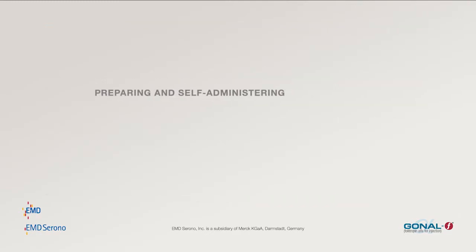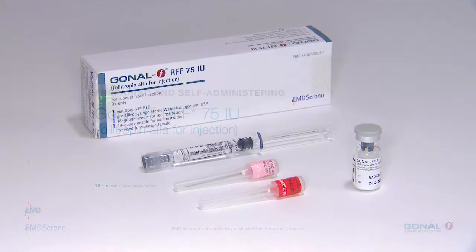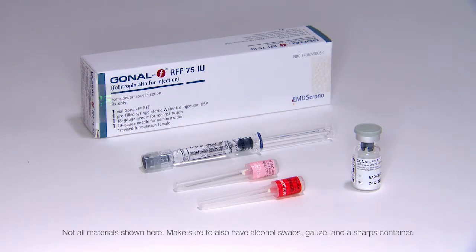Preparing and self-administering Gonal F RFF 75 IU. Getting ready. Be sure to have all of the following items before you begin: Gonal F RFF 75 IU powder vial, pink mixing needle 18 gauge 1.5 inch, red injection needle 29 gauge 1/2 inch, pre-filled syringe labeled sterile water for injection USP, alcohol swabs, sterile gauze pads, and a sharps container.